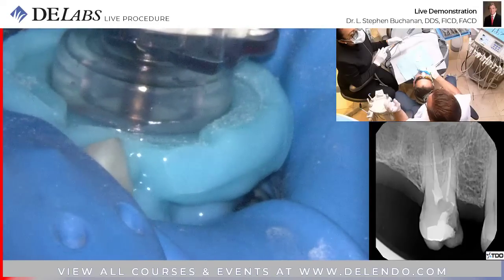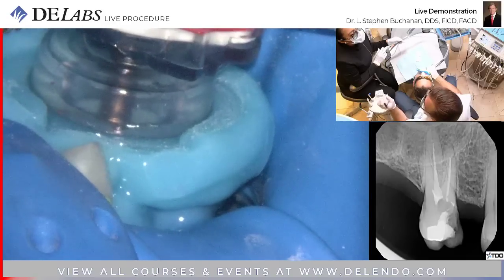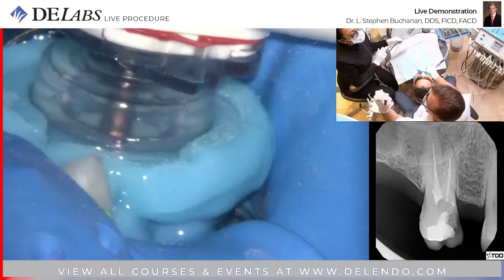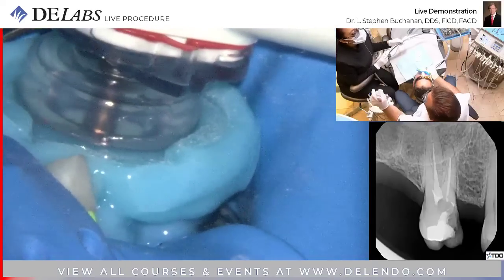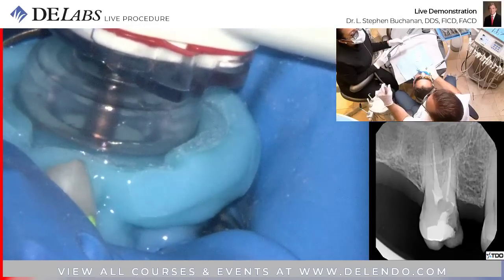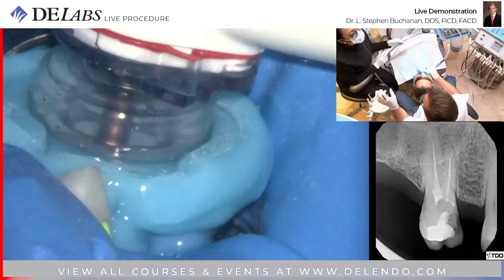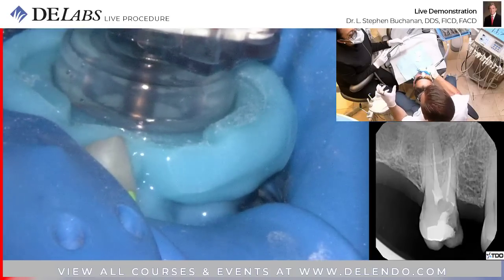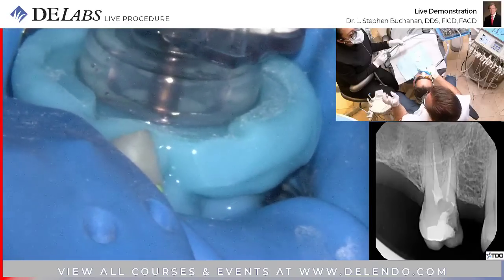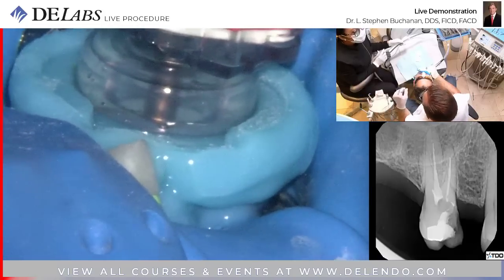And what you see, I've never seen it before, is the smallest lateral canals, the furthest away, getting vibrated and cleaned first, and then the last thing is the primary canal. If you left a pulp in there, you'd have a little space alongside the pulp, between the pulp and the dentin wall, and nothing next to it. The dentin wall is perfectly clean. It's just a pulp sitting in there, because these waves propagate only on the surface of the canal wall.